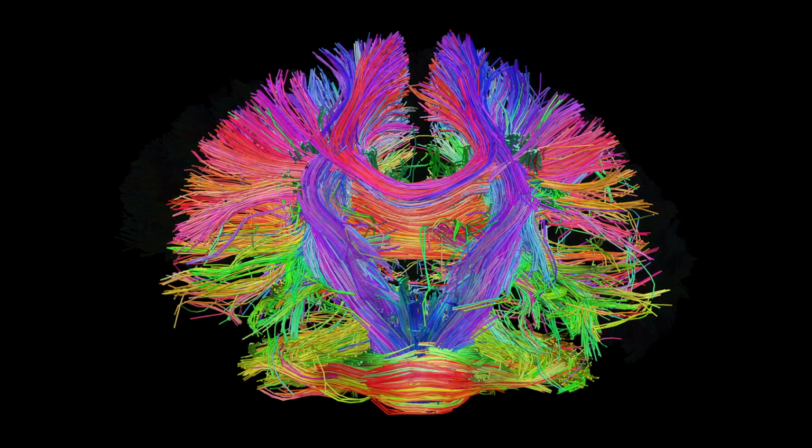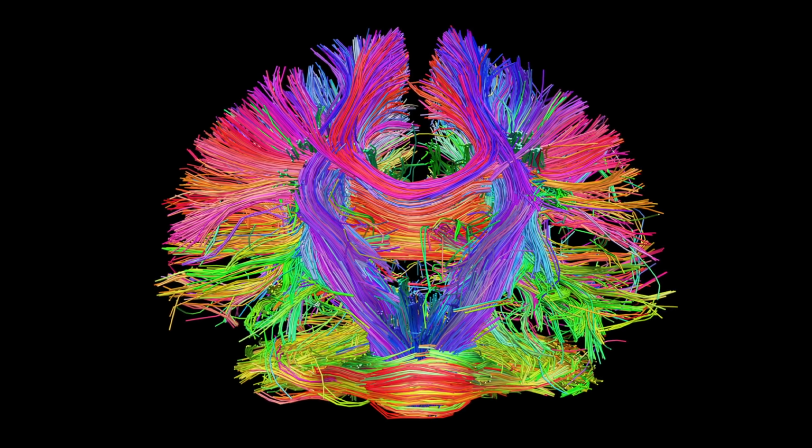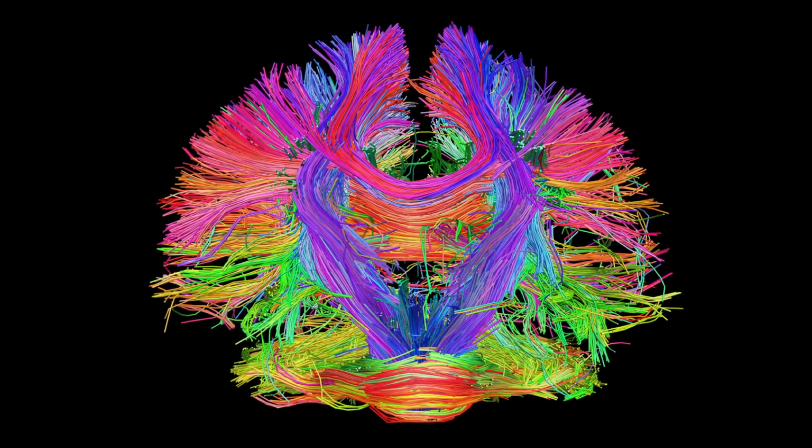and we can look at the physical tracks of neurons that go from the spinal cord or the brainstem into the brain and then back out again. We can look at things like the corpus callosum, which is essentially the superhighway between your left and right lobe, and we can see if there's damage there.